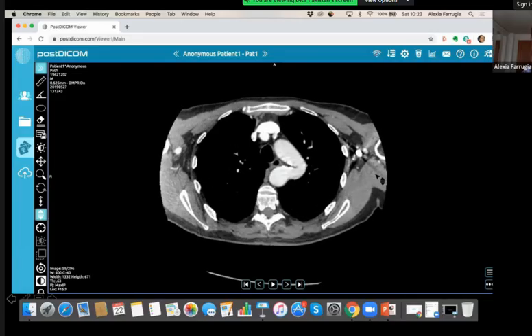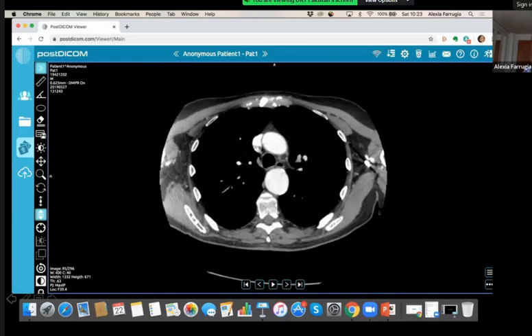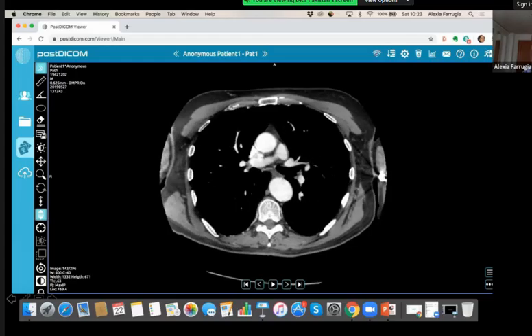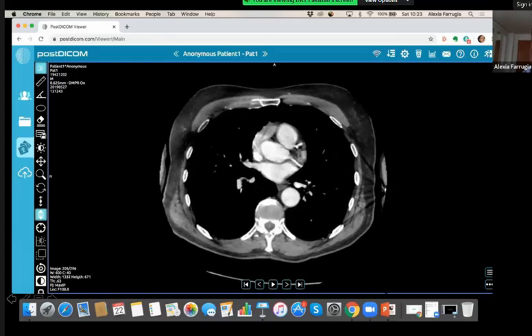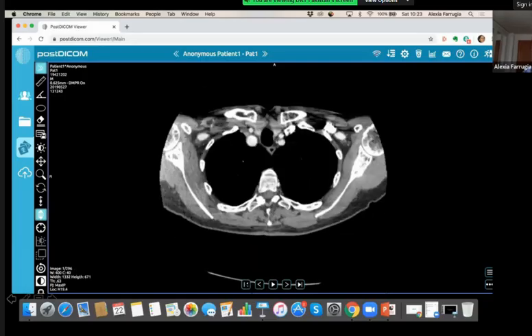Then you can tell me what you see. Okay. So let's go through that again.